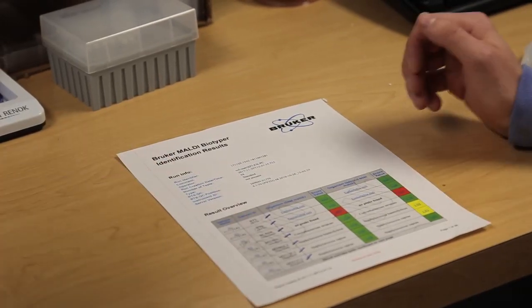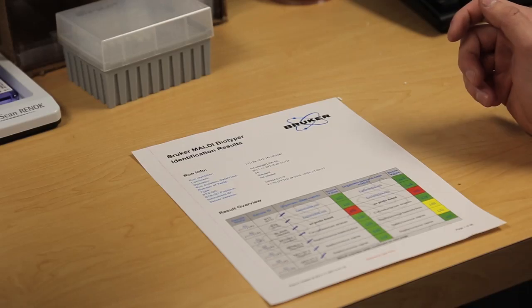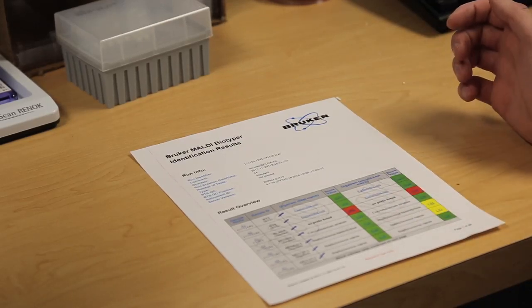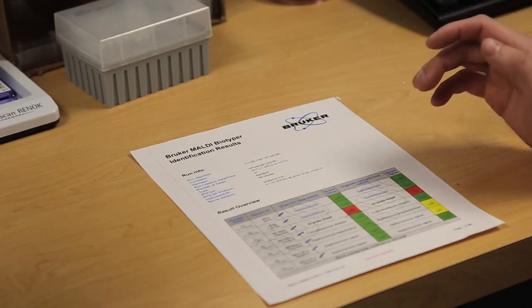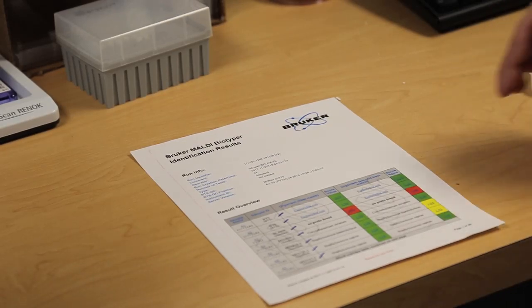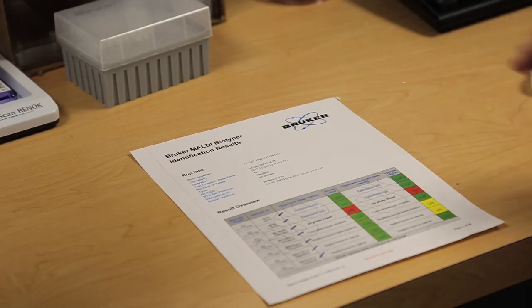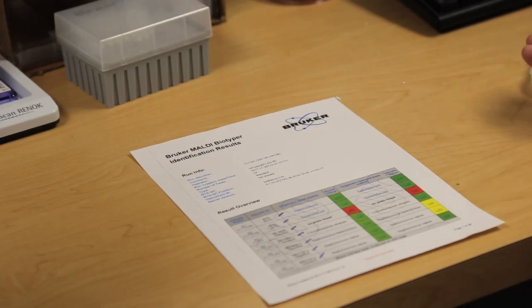Yeah, so this is our plate with a couple samples. Essentially all the ones that we're seeing that are green had a score above 2. And anything with a red score is a score below 1.6. Okay. And then anything with yellow is between like 1.6 and 2.0. And those are IDs that are okay, but they don't match to the database as well, so we can't report it to the species.